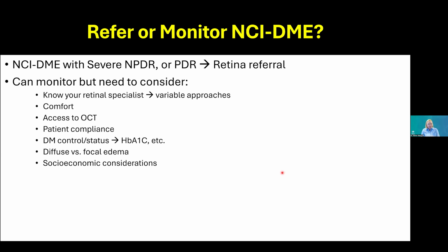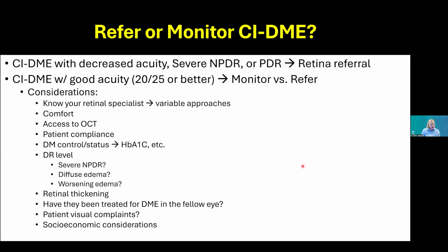A lot of the focal edema I definitely feel more comfortable with than diffuse edema. I tend to see more diffuse edema in very uncontrolled diabetic patients or patients whose diabetic retinopathy is progressing. So that makes me a little worried that the patient's going to continue to progress, especially if it's close to that center subfield. And then, of course, socioeconomic considerations need to be made as well.